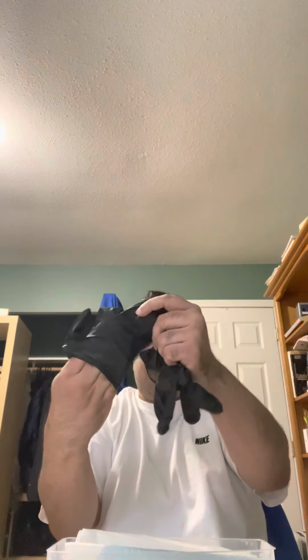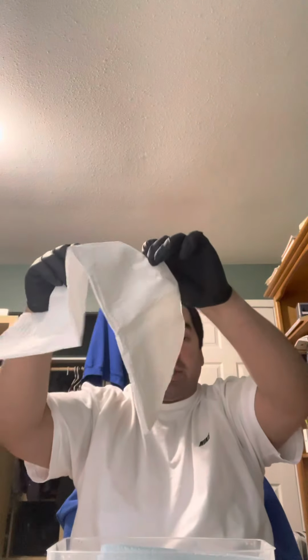I will then apply sterile gloves. As you can see, these gloves are too small, maybe two sizes too small. I'll at this point pick up the square drape and allow it to unfold without touching any unsterile surface.